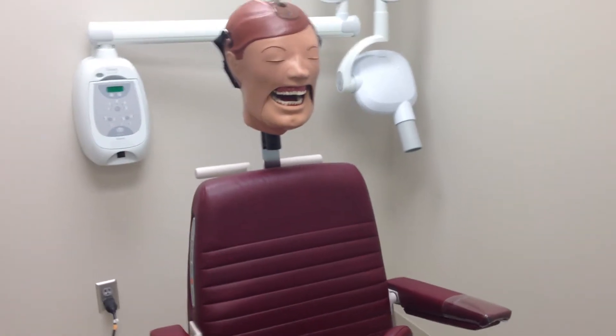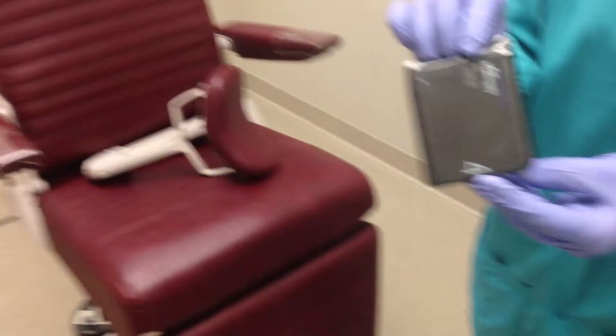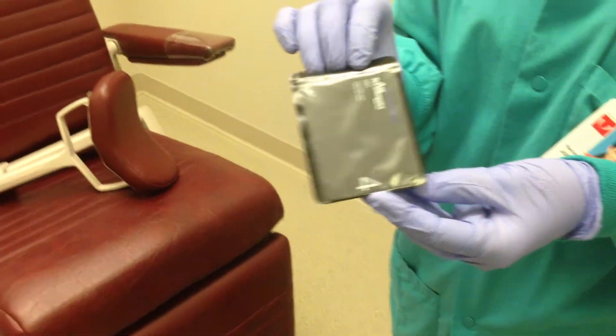Today we will be showing you how to take a maxillary standard occlusal radiograph. You will need a size 4 phosphor plate and will use a round PID.